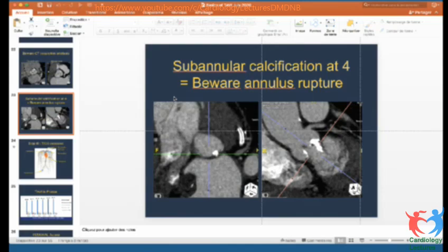This situation will let you go to the other valve with the self-expandable, because sometimes you cannot have 100% of the procedure done with one valve. So unless you refer your patient to another doctor or another team, unless you have experience with the other valve. When there is no calcium, when there is severe AR, when there is a valve in valve situation, I'll try to avoid balloon expandable. Okay, great.